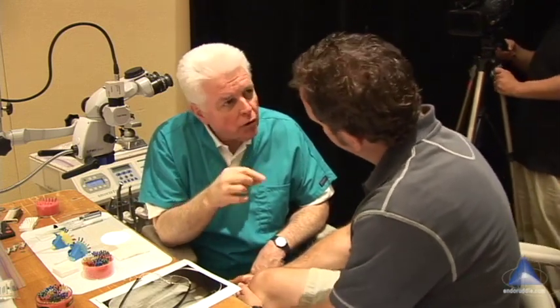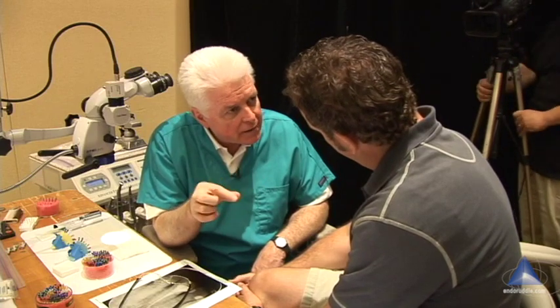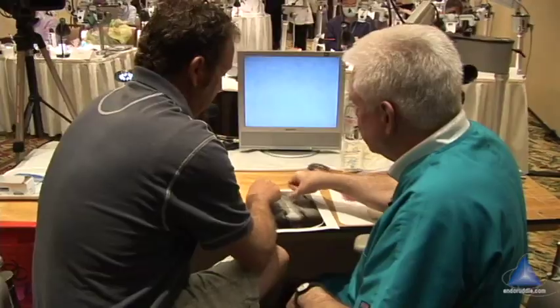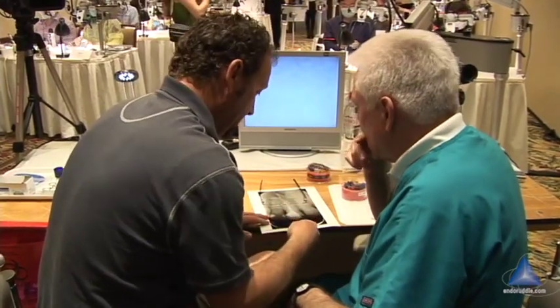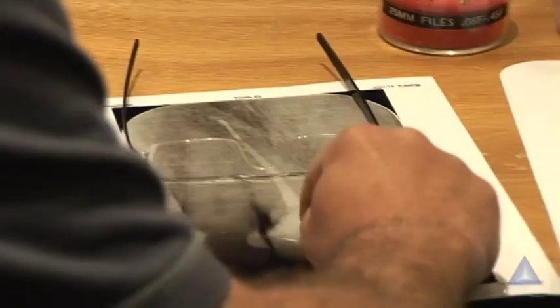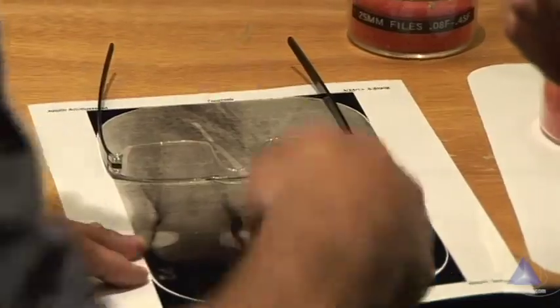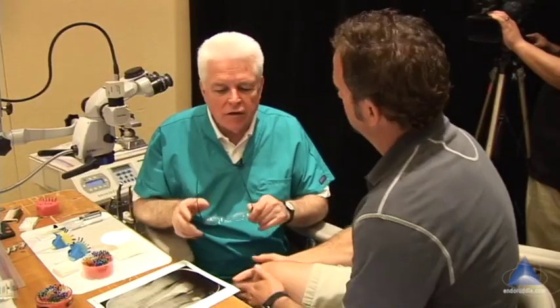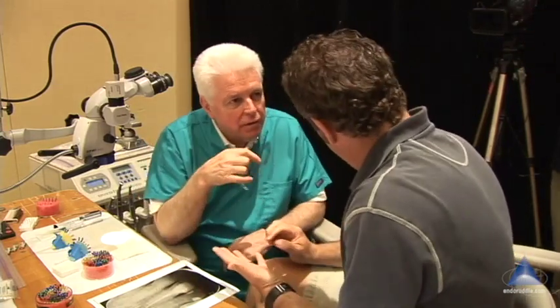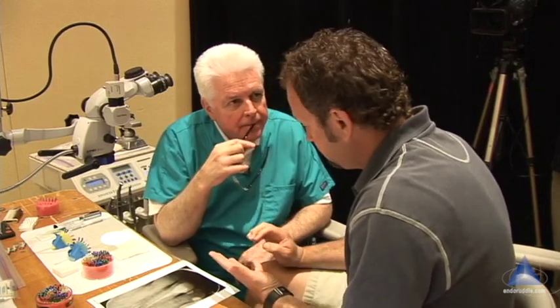So when you down-pack, you are taking pieces out incrementally — you're not doing the classic continuous plunge. You're doing interrupted. I got my gutta-percha sticking out here, I sear it off at the orifice, I start packing it — heat, pack, heat, pack. Okay, we're doing the same. I'm just trying to find out all the little things because at some point we're the same, I'm looking for the difference. I think it might be viscosity of the sealer, and maybe too much on the cone, because I put a fair amount of sealer on that cone.